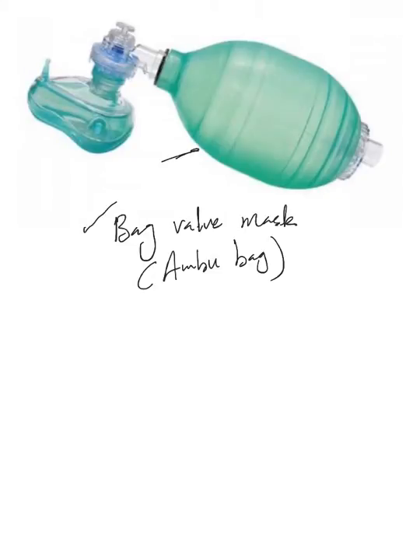This is an ambu bag here. The real name is bag valve mask, but in the hospital setting we always say ambu bag, or 'start bagging the patient,' which means connect him to the ambu bag and start squeezing it.